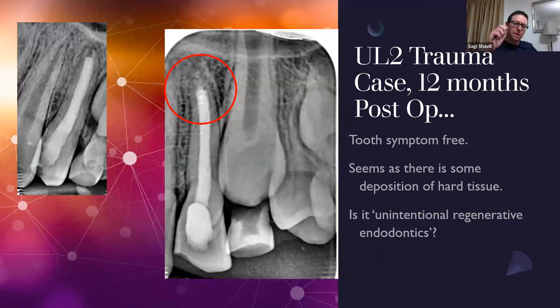Totally agree, especially in apicectomies where you know you're going to get bleeding. You know, it may wash away. Wait a couple of minutes. Just make sure it stays there. Those 2-3 minutes, and then that's about it.